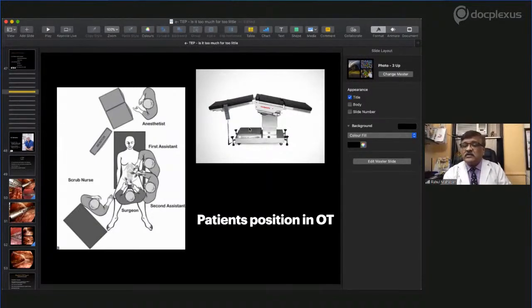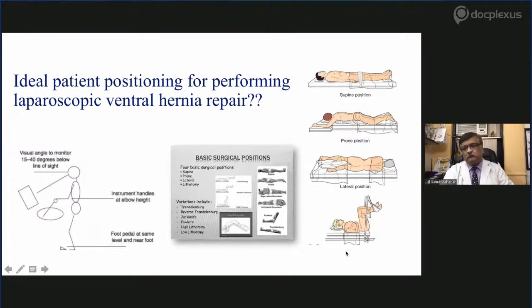But as Flavio has rightly mentioned, you have to ask the patient's history, whether he has undergone spine surgeries or not, because that creates a problem for giving these positions. I have operated on 2-3 patients with spine surgery, but in those cases I have not done this flex position. I have done it in a completely supine position, because I asked the operating spine surgeon whether I could go ahead with this position. He said it is not possible. If you do this, the implant which they have put inside will break completely. So it is not recommended, and we have done that procedure in supine position. It becomes a little difficult for us, but yes, you can do that.